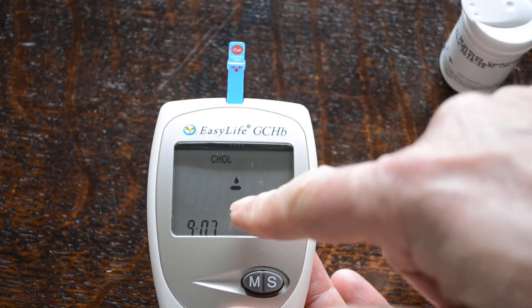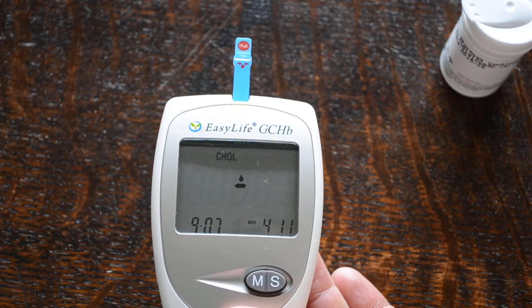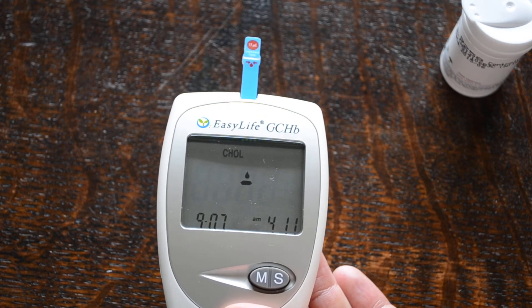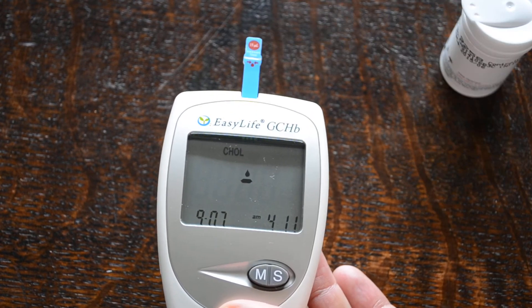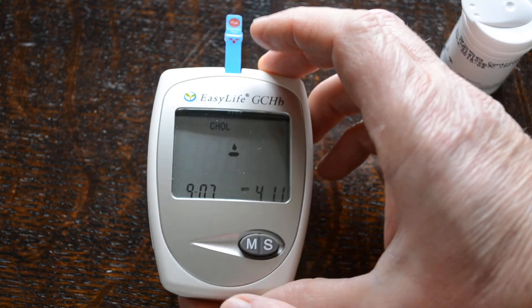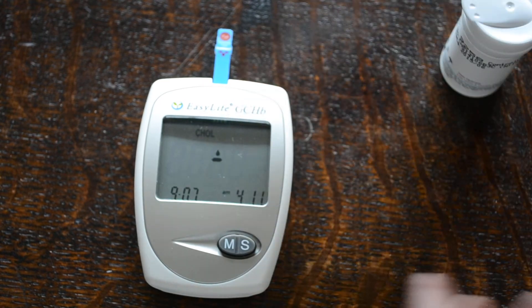Now the meter is asking to apply a blood sample to perform a test. Very simple — a finger prick lancet from the auto lancet device and lancets supplied with the meter. Blood is just applied onto the test strip and the meter will automatically indicate the cholesterol level in the sample and enter that into its memory system.